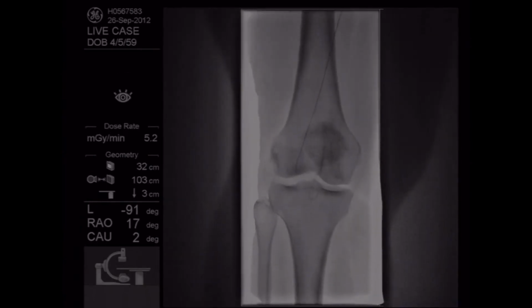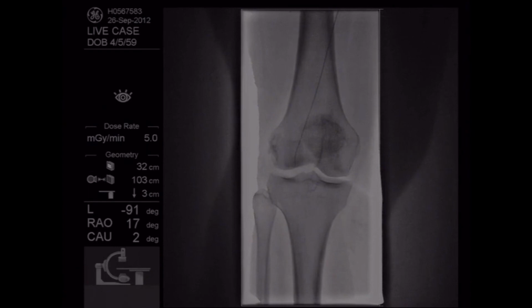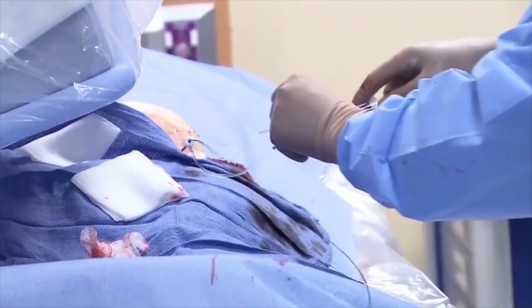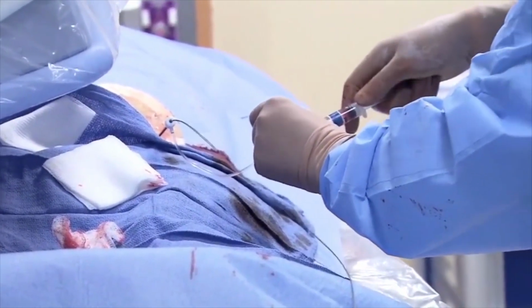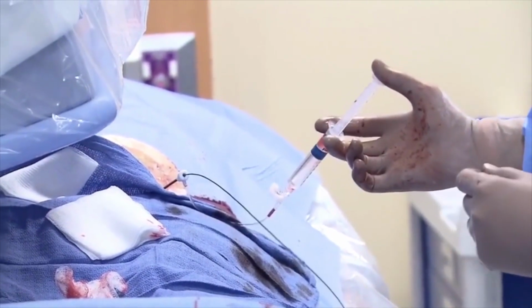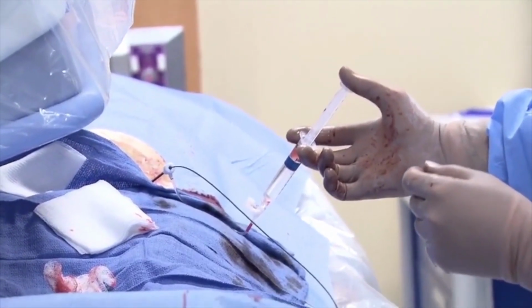And we're going to put a distal protection filter, which is sort of like a little wind sock made of mesh metal. We're going to deploy that down into the popliteal artery here, below the level that we're treating. And the purpose of that will be to catch any debris that might otherwise embolize to the foot during the course of our procedure.